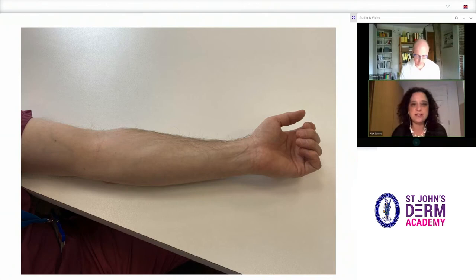We line up our patient exposing the forearm; they would have been asked not to have used any antihistamines. For long-acting antihistamines, we usually ask avoidance for five days, and 48 hours for short-acting ones. In practice, that often doesn't happen, so when patients have not been able to stop the antihistamine, we would do a positive control first. If that gives a decent wheal of three millimetres or larger, we go ahead with full testing. Otherwise, it would be better to arrange for specific IgE testing on the blood.